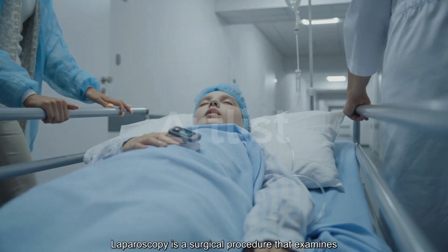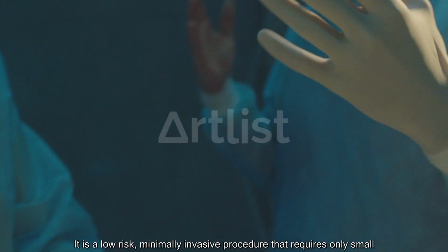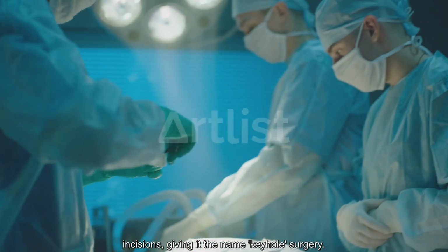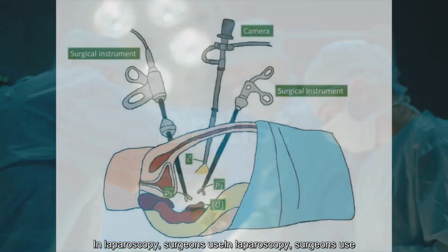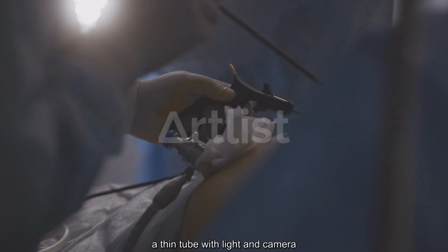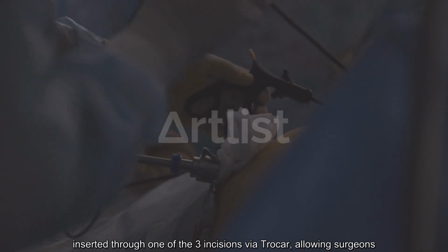Laparoscopy is a surgical procedure that examines the organs inside the abdomen and other closed spaces. It's a low-risk, minimally invasive procedure that requires only small incisions, giving it the name keyhole surgery. In laparoscopy, surgeons use a specialized instrument called a laparoscope, a thin tube with a light and camera, inserted through one of the three incisions via a trocar, allowing surgeons to pass instruments and excise tissues.